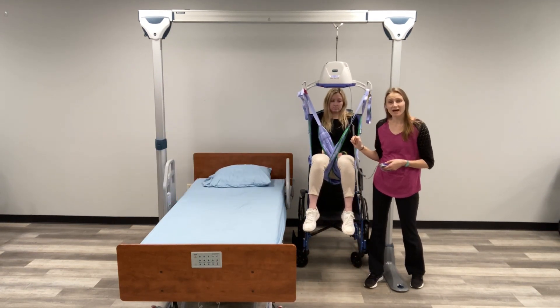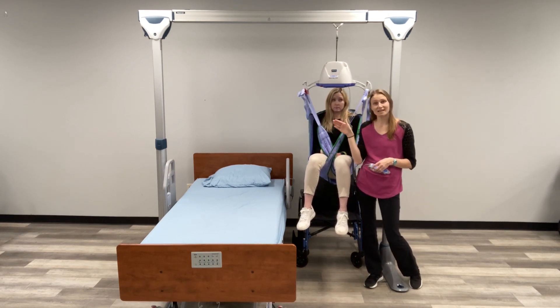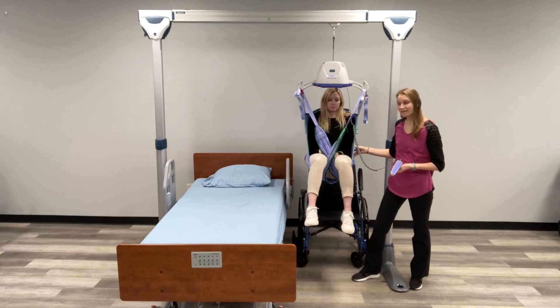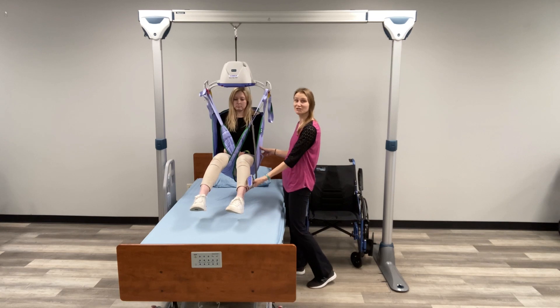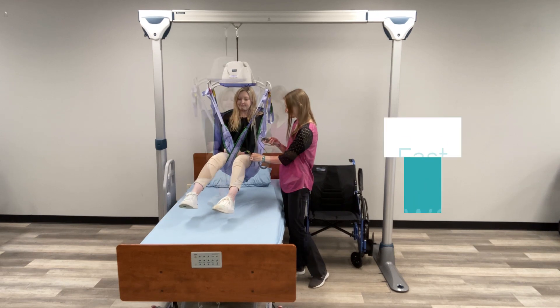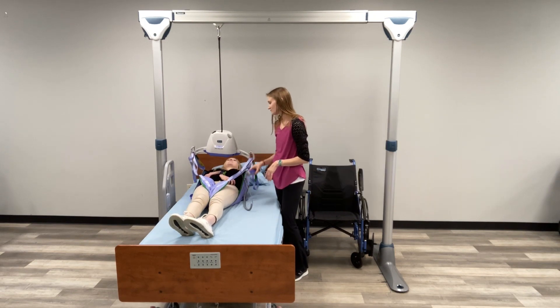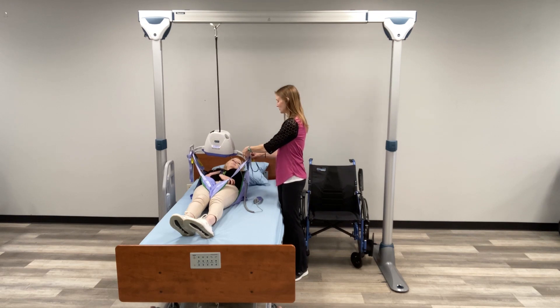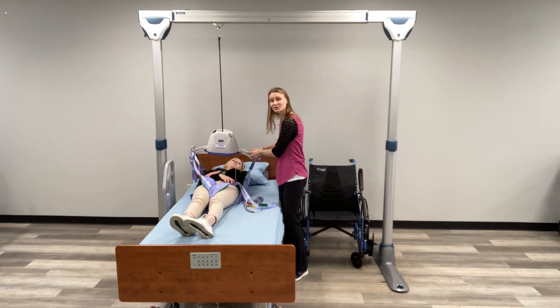Now that we are up high enough, this is where you'll really see the difference between a standard sit-to-stand or Hoyer lift and an overhead lift. Now that it's time to move over to the bed, all the effort it requires is one-handed slowly moving over to the bed on this pulley system. Make sure you're clearing your feet. Now that we're positioned exactly where we need to be, we're going to go ahead and lower down. Now that we are fully lowered, I can go ahead and unhook the sling from the unit, lift it away, and push it out of the way.